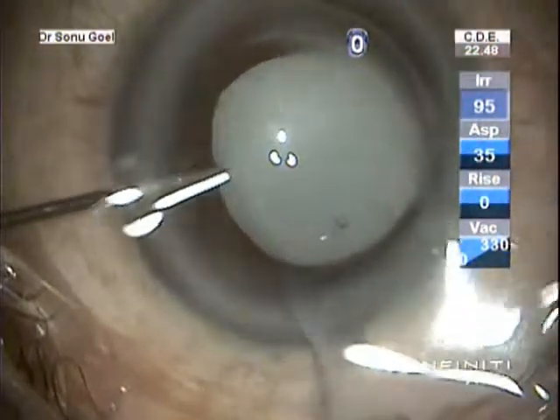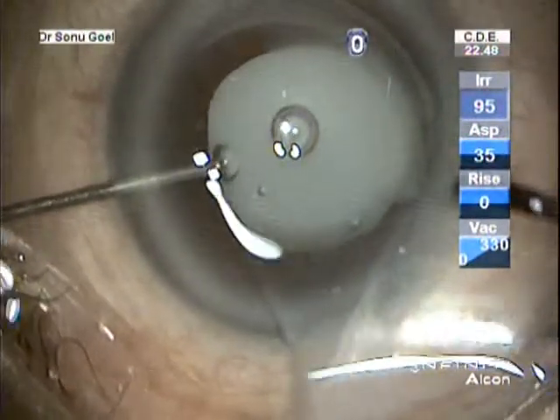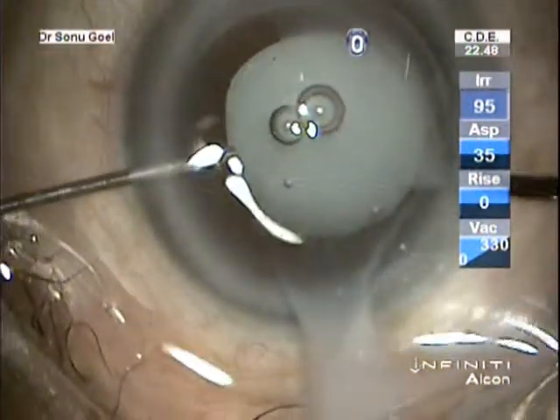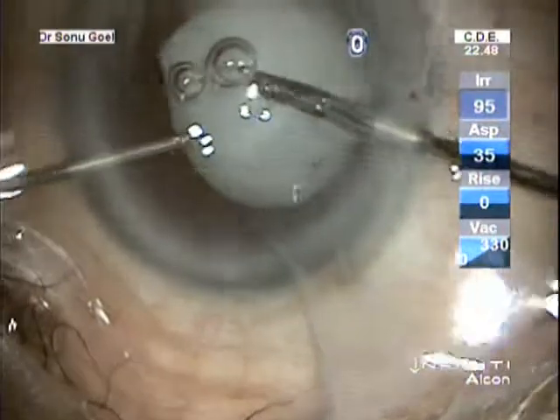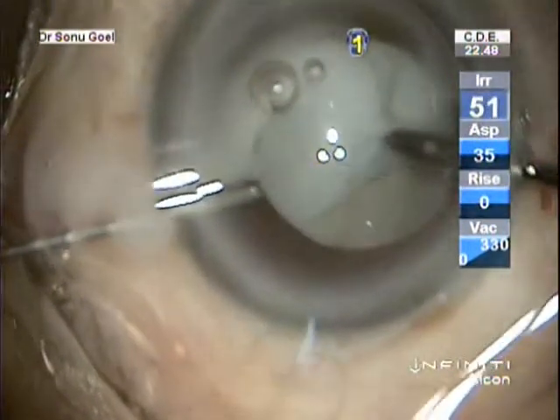We can exchange this by using a micro Capsulorrhexis forceps. Even if the patient squeezes, the globe can be stabilized. So this Capsulorrhexis forceps can then hold and the rhexis can be completed within a single go.